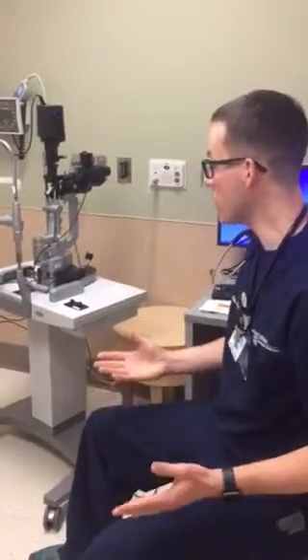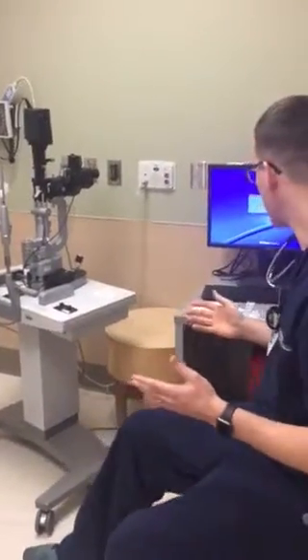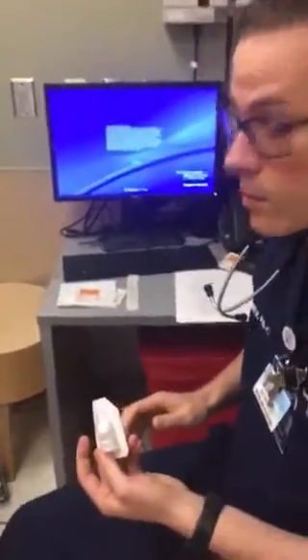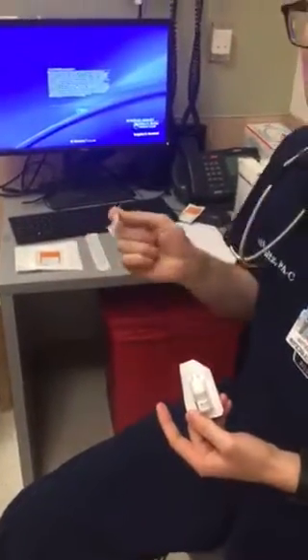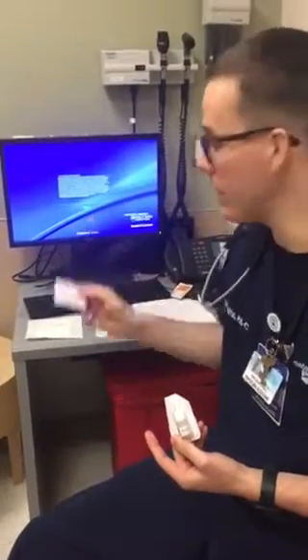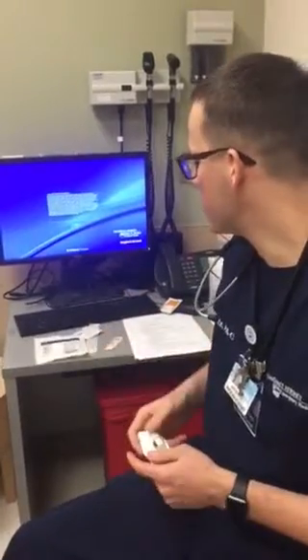The first thing you want to do before you even start your slit lamp exam is gather appropriate supplies. Things you may need for the slit lamp include tetracaine or proparacaine, a fluorescein eye strip to do staining to look for abrasions or ulcerations, cotton tips for eyelid eversion, an alcohol swab to disinfect the slit lamp, and some gauze or a tissue for the patient's tears.